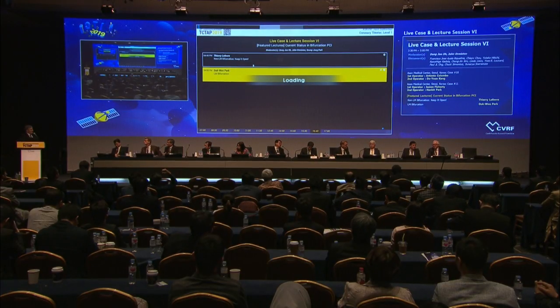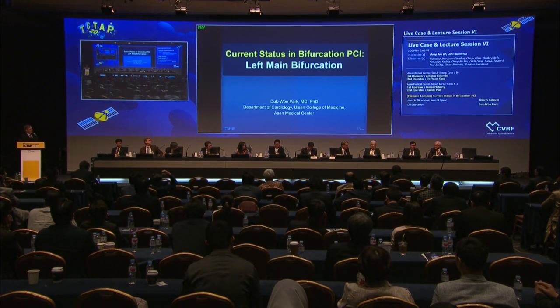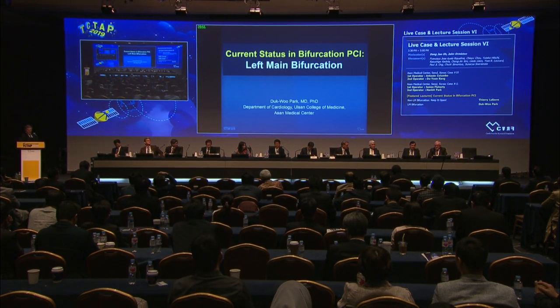I want to ask one question about the angle. I always have a question for Thierry. So, Thierry, you explained something that we have been saying for a long time, which is that we choose the stent from the diameter of the main distal vessel. But how do you measure it? Is it media to media IVUS? Is it OCT or is it angio, QCA? How do you measure it?